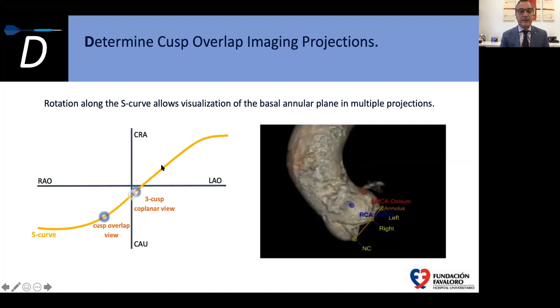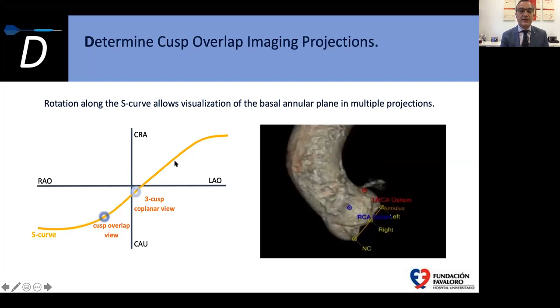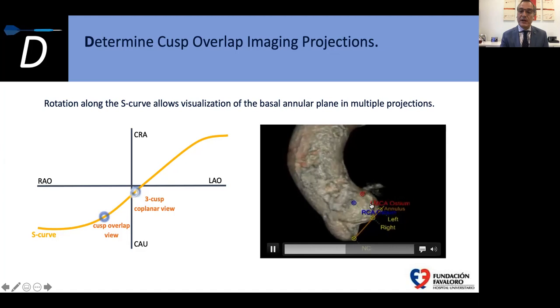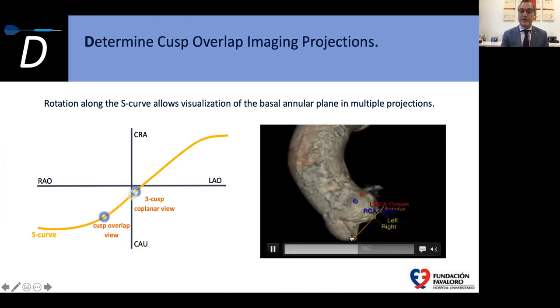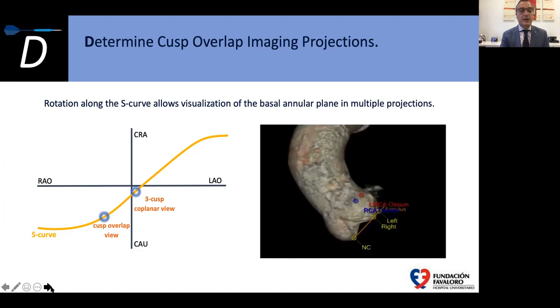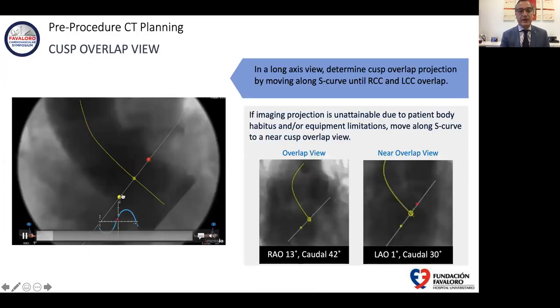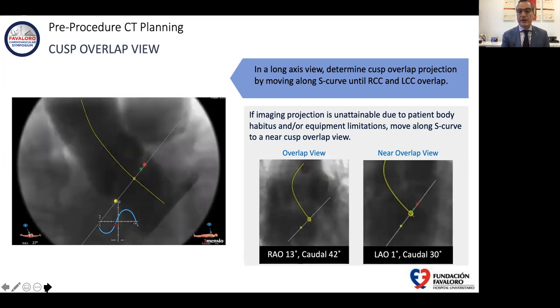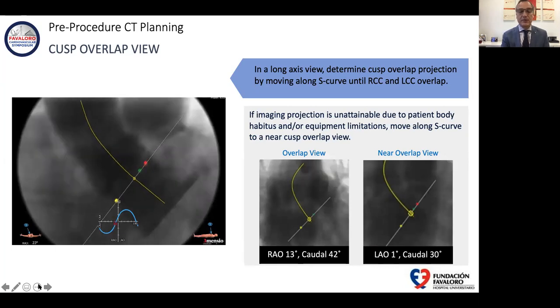As shown in this S-curve made with CT evaluation, we move from the right oblique view to the caudal view, rotating the aorta to overlap the two cusps and achieve better alignment of the annulus. In real life, this is how we rotate — the aorta rotates and we overlap these two dots to obtain the cusp overlap view in the right caudal view.